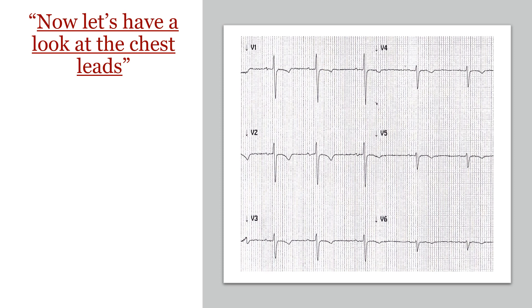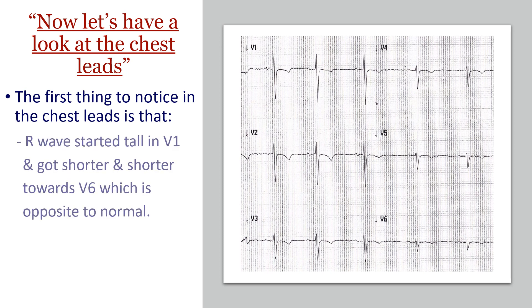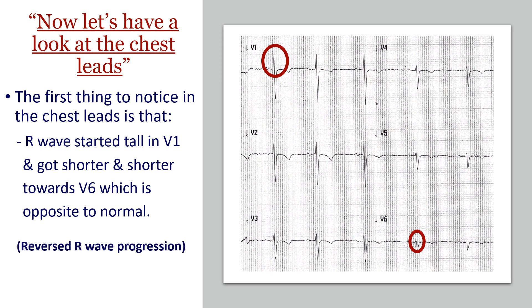So let's look at the chest leads in our case and see if they were normal. From V1 to V6 there are a few abnormalities. The first is R wave progression — the R wave started tall in V1 and got shorter and shorter all the way down to V6, which is clearly abnormal. Normally I would expect a small R wave in V1 that gets bigger toward V6, but this is the exact opposite. This is reversed R wave progression.